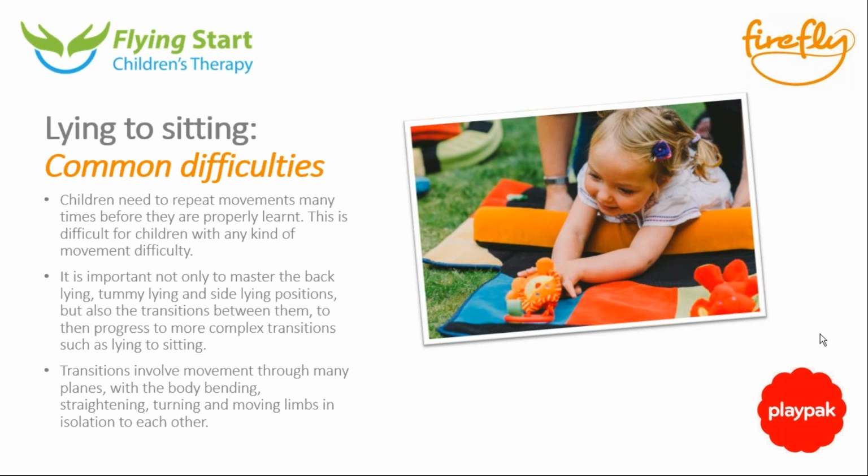And I would still practice these if a child is not necessarily able to do this by themselves. I would still try and teach as many of the skills as possible, so that as they grow and get older, it might help with them walking or might help with them standing later on.